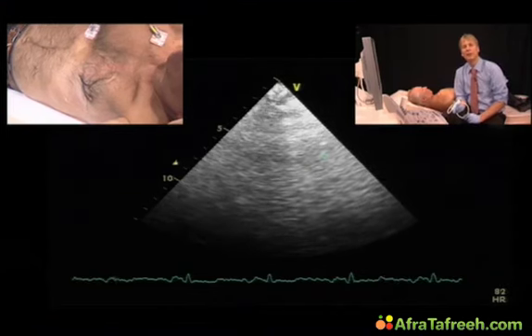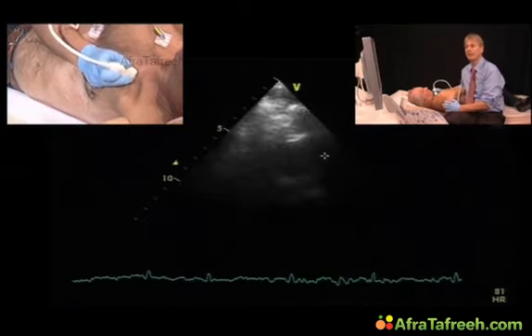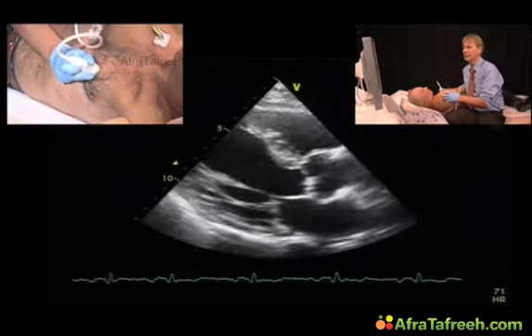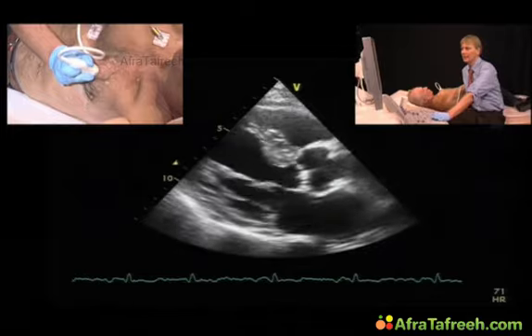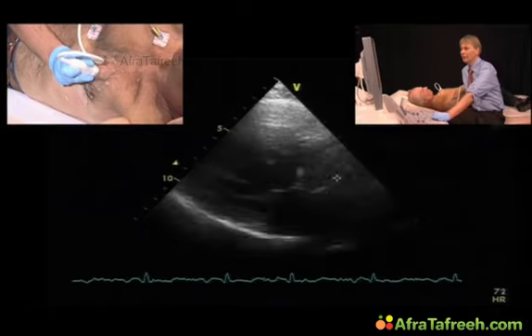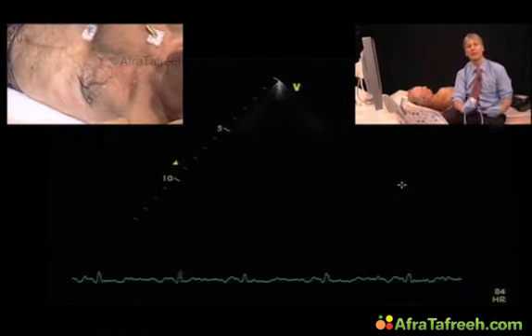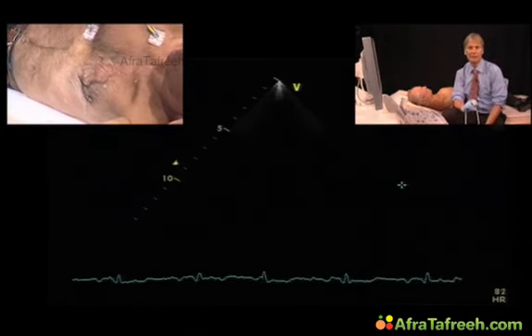What's very important and what we always forget is that patients can also be assessed with respect to atheromas and plaques in the ascending aorta. And this is a patient who has a known coronary artery disease, an inferior infarct. If we take a look at the ascending aorta, we can see that there are calcifications here in the sinotubular junction, both here and here, which are indicative of atherosclerosis. And the TEE in this patient also showed that he has plaques not only in the ascending aorta, but also in the aortic arch and also in the descending aorta.